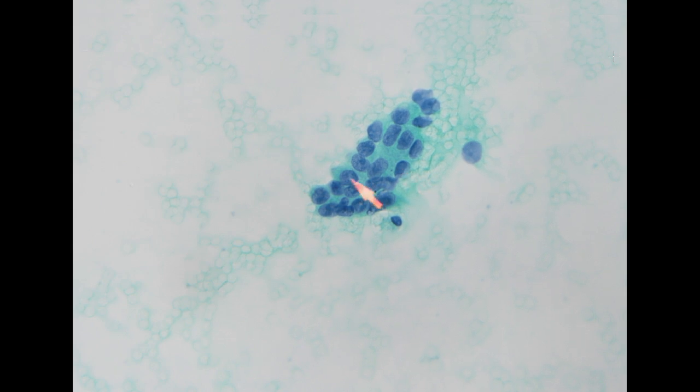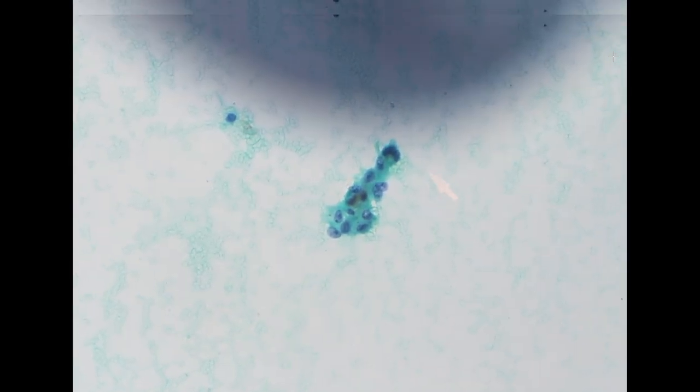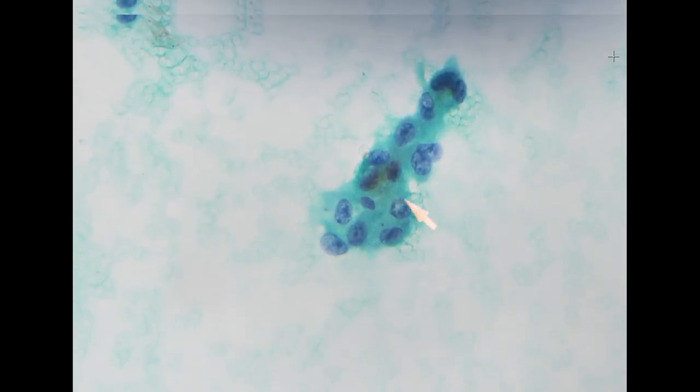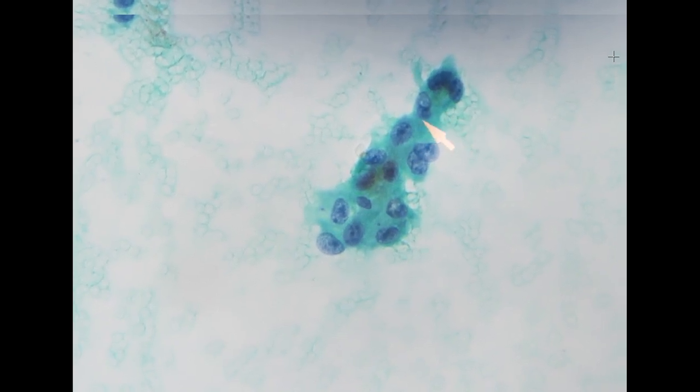So the glandular arrangement with a small type of rosette is more common that we will see in prostatic cancer. For this particular case, the nuclear atypia is a little bit more severe than the usual relatively uniform morphology of a prostatic cancer. However, because of this small acinar type of growth pattern, this is more likely to be a prostatic origin than the primary lung origin.